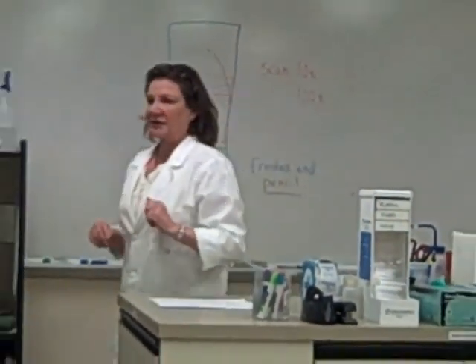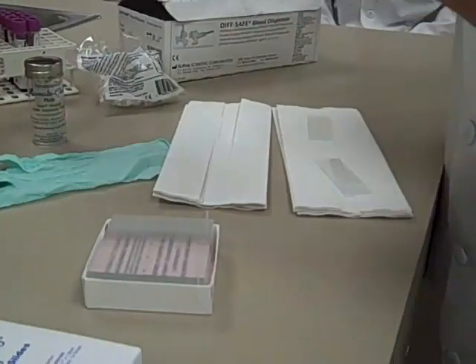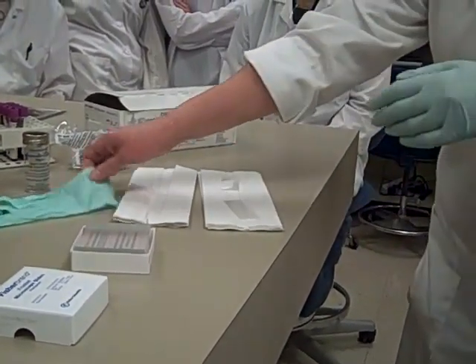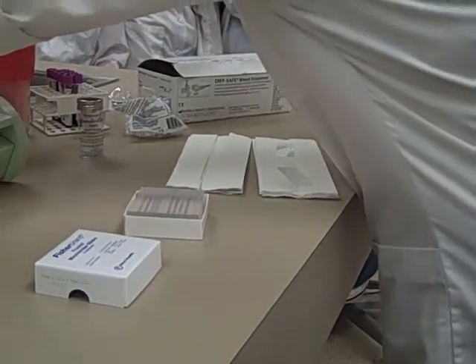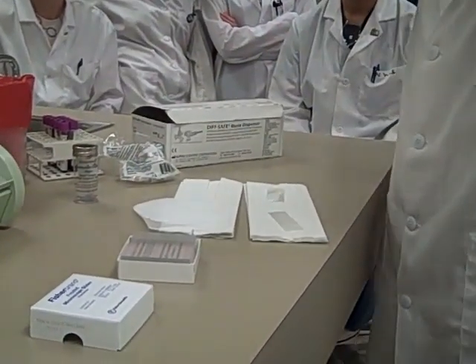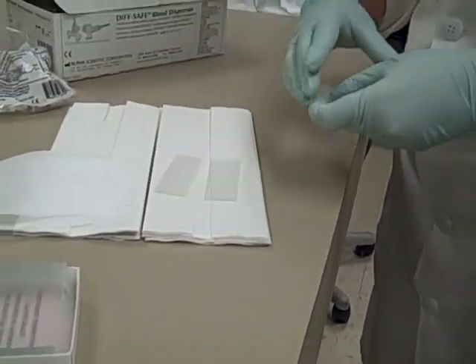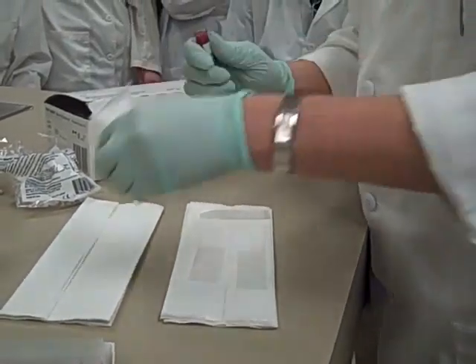Now I'm going to go ahead and actually demonstrate with some blood. I've got my slides out, I'm putting my gloves on. I am right-handed — if you're left-handed, you just do it backwards. I've got my chem wipes and my blood mixed. You probably only want to start out with about two slides at a time. You want your frosted edge up.